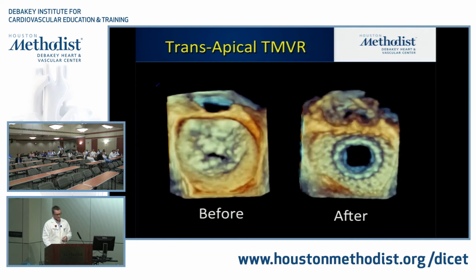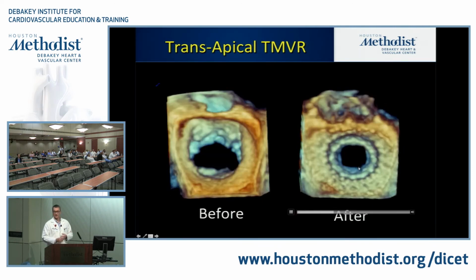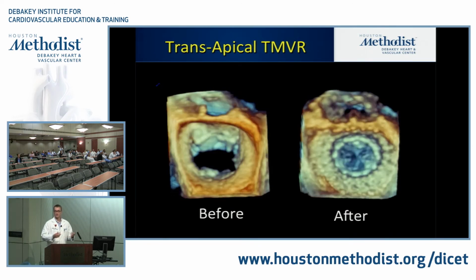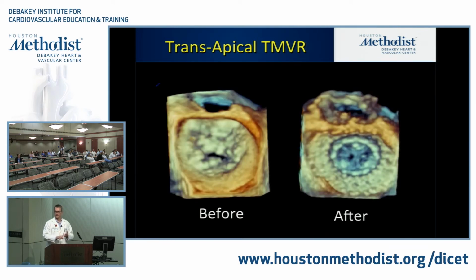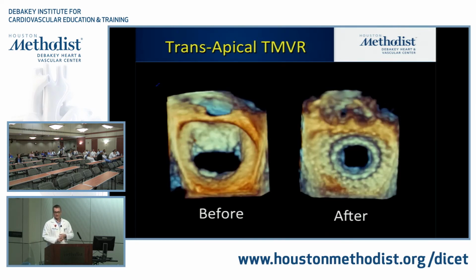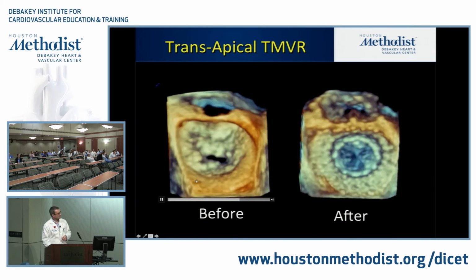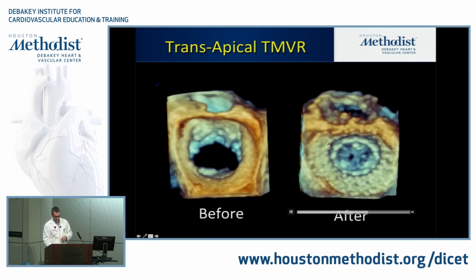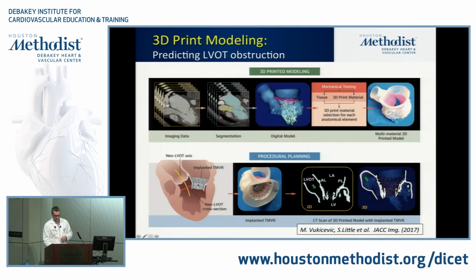I wanted to give you these couple of slides and talk about TMVR because we're doing more and more discussion around that. We now have multiple ways. With the sonographers, there's some confusion about post-TMVR, so it's better to use valve and ring, valve and band, valve and valve, or valve and native valve, which is this one. That's a nice before and after, and you see that little trough that has to fill in over time.